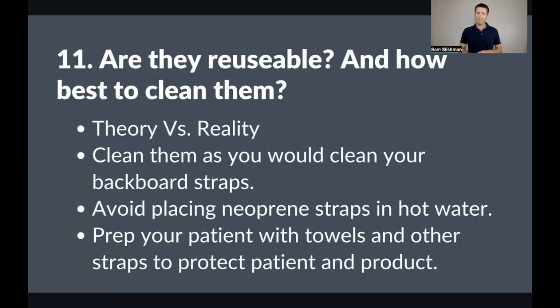To clean them, there are just a few points I would make. Clean them like you would a strap on a backboard. Avoid putting neoprene into boiling water, though, so that it doesn't delaminate. And to protect them, if you are going to use them more than once, I typically put a towel around the groin just to keep any urine, feces, or blood off the groin strap in particular. But those are the main points.